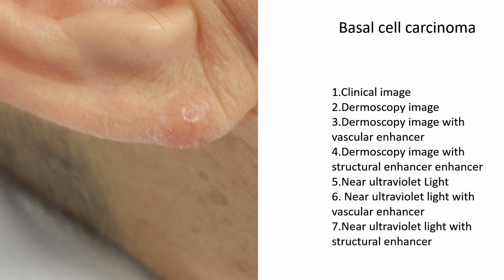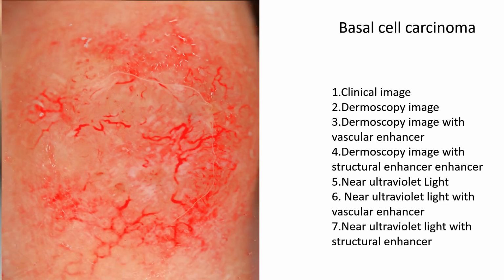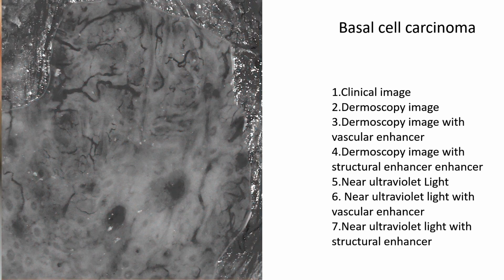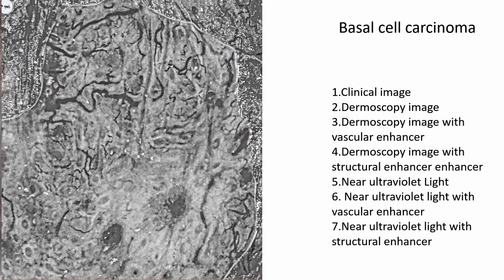Last final case, this papule of the ear. We see here these serpentine vessels, here with the vascular enhancer, the structural enhancer, beautiful vessels, the near ultraviolet light with the vascular enhancer and structural enhancer.